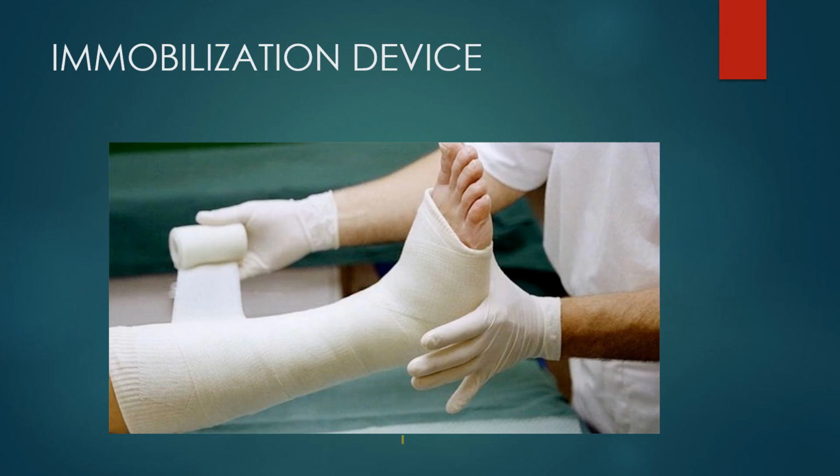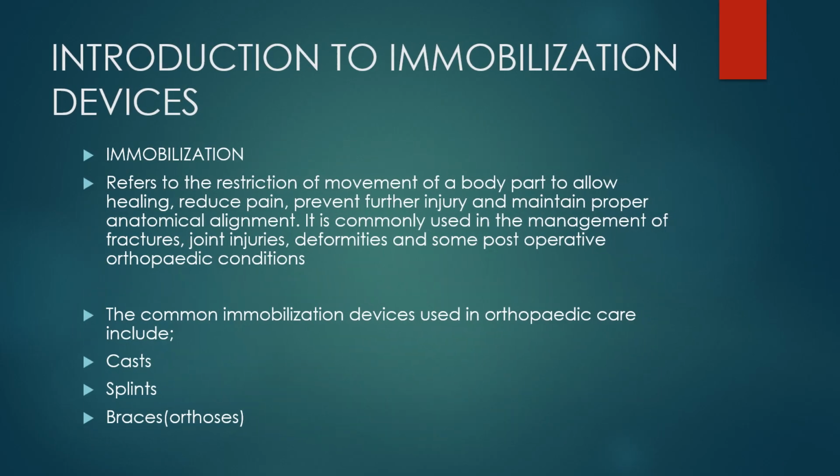And today we are going to continue with immobilization devices. So let's look at the introduction to this topic. So we'll start with what immobilization is.